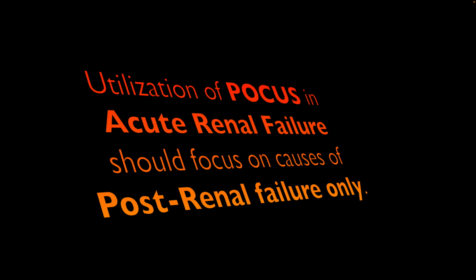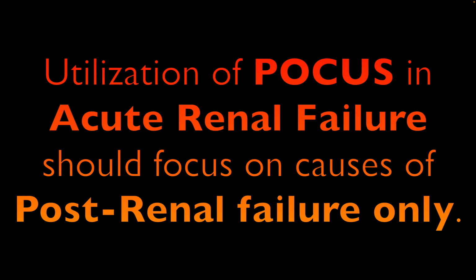So if you get anything out of this lecture, the one thing I want you to remember is that the utilization of point-of-care ultrasound or clinical ultrasound in acute renal failure should focus on, and only focus on, post-renal failure. Now, there are some utilities of ultrasound. Maybe you want to know the blood flow to the kidney, but that, in my mind, is not a point-of-care ultrasound study. That is a consultative study that requires more time.